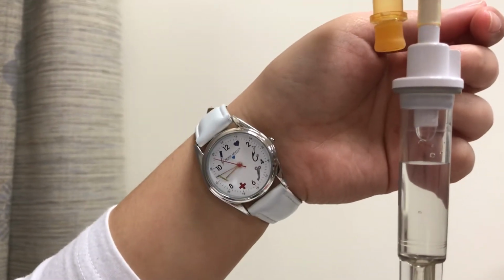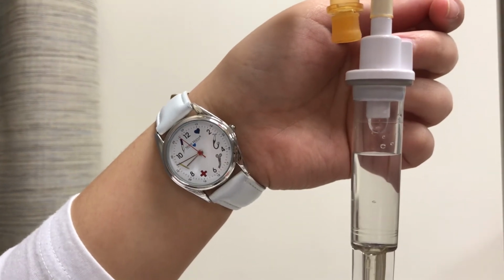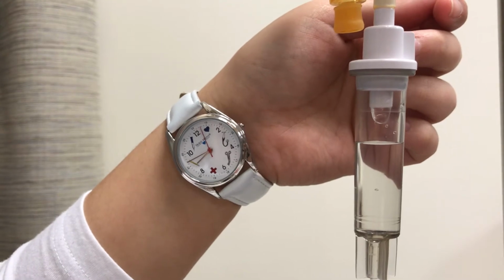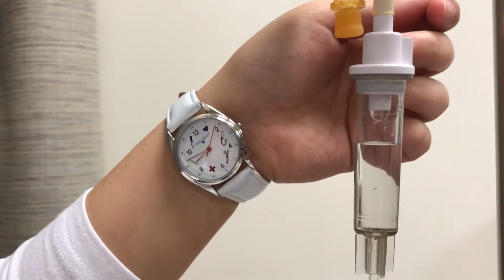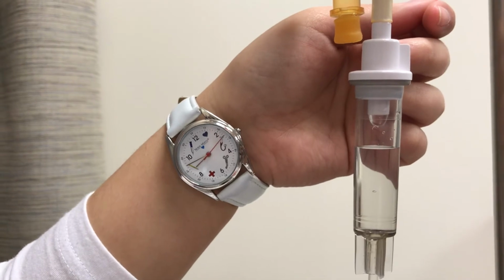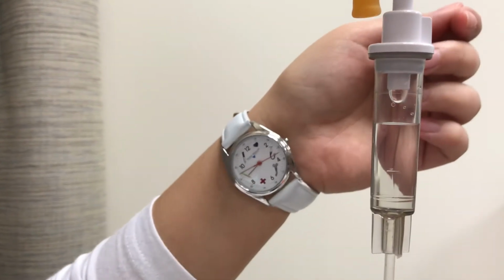This is medication, so I did it 7 right. Right documentation, right drug. Okay. Again, checking right patient, right time. Okay. First of all, I put the bed side. After washing my hands, I will assess. Okay. And that is 4 drops per 15 seconds.